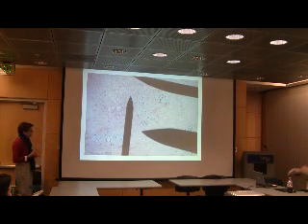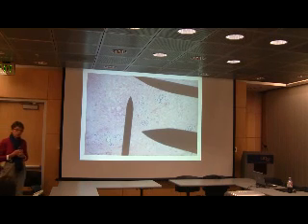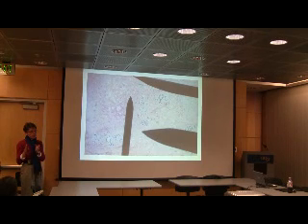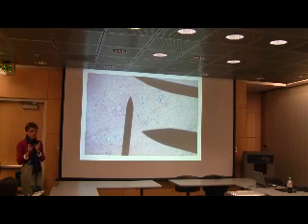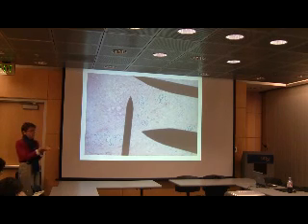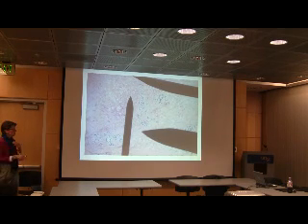All right, so what I actually do for a living is cytology, and I do a lot of fine needle aspiration biopsy. You can sample the breast in different ways. What we talked about so far is when you have a piece of tissue that has been removed by surgery, and you take a piece of that, embed it into paraffin and cut it. You see such an example here in the background. For instance, here you can see a ductule happened to be cut, so you can see it leading into this particular lobule. This is taken under much lower magnification, so you see it more at a distance.